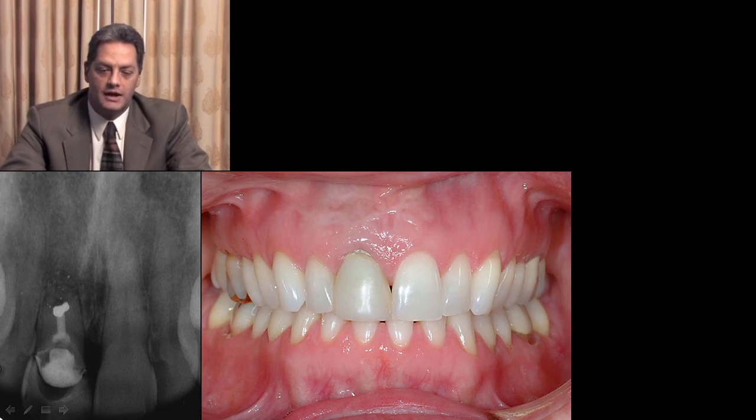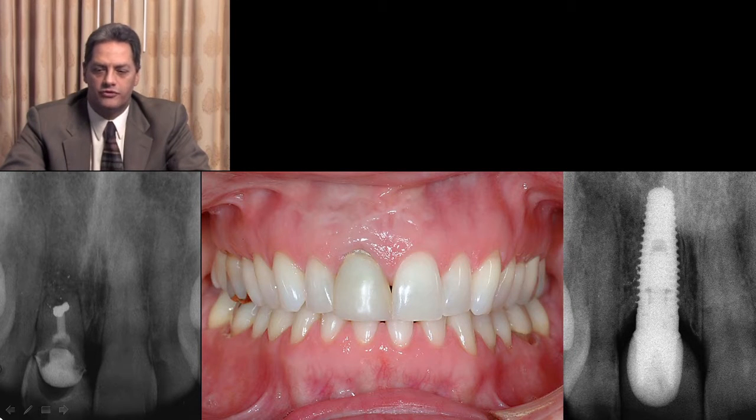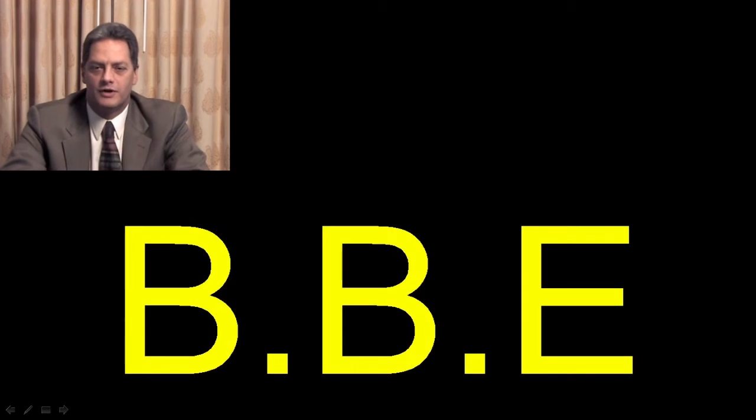While the patient declined to have orthodontic treatment, even with this little root, we wanted to do the super option, but that was not the patient's choice. So we move from the original situation into a situation that's now a stable one with the implant-supported crown. This treatment has been something that we provide to our patients for the past 30 years.